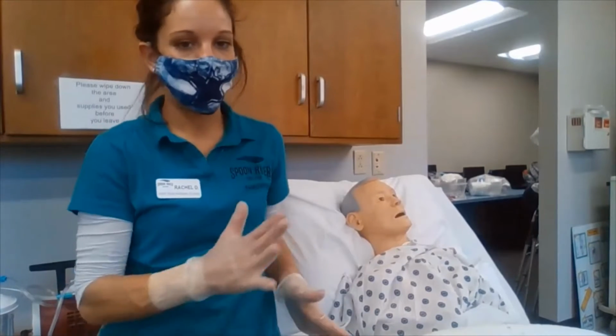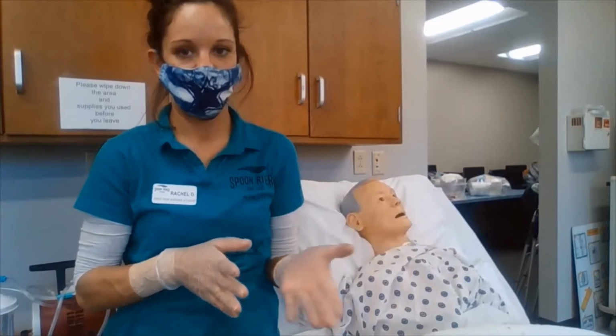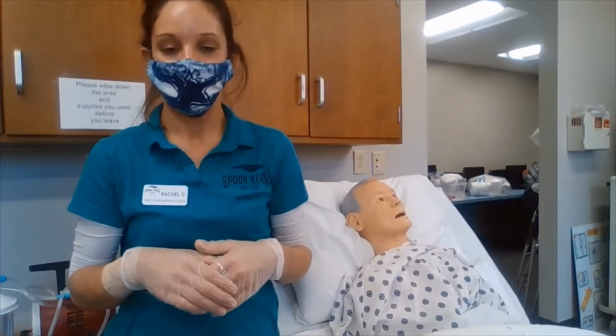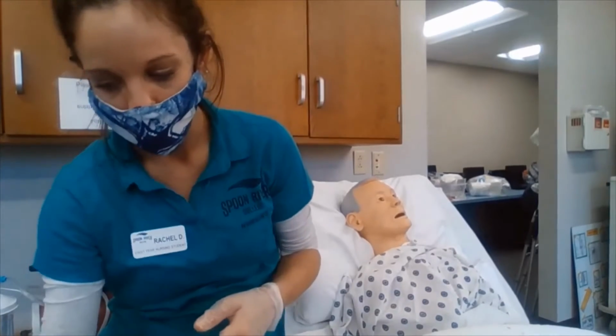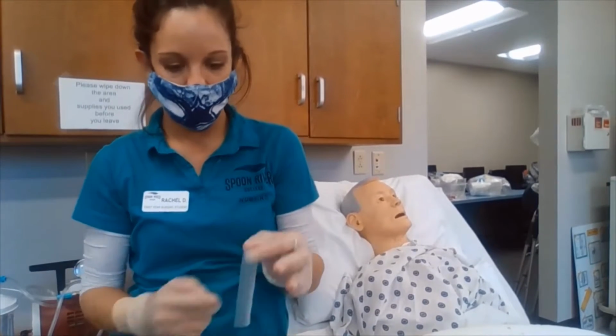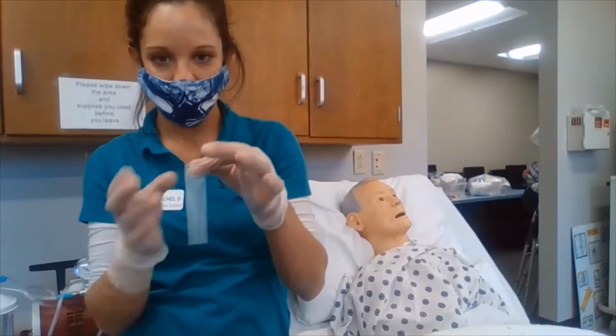If we are right-handed, we are going to be standing at the patient's right side. If we are left-handed, we're going to be standing on the left side. We are going to prepare the fixation device, or we are going to cut about 4 inches of tape, and we would split it about halfway down the middle, lengthwise.